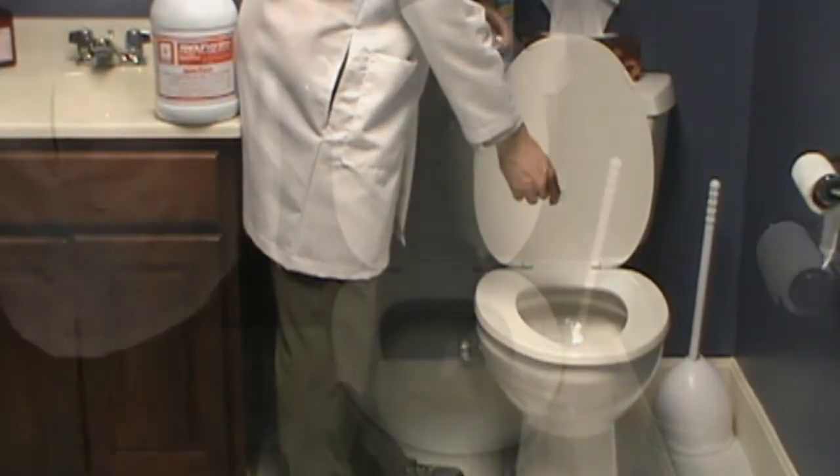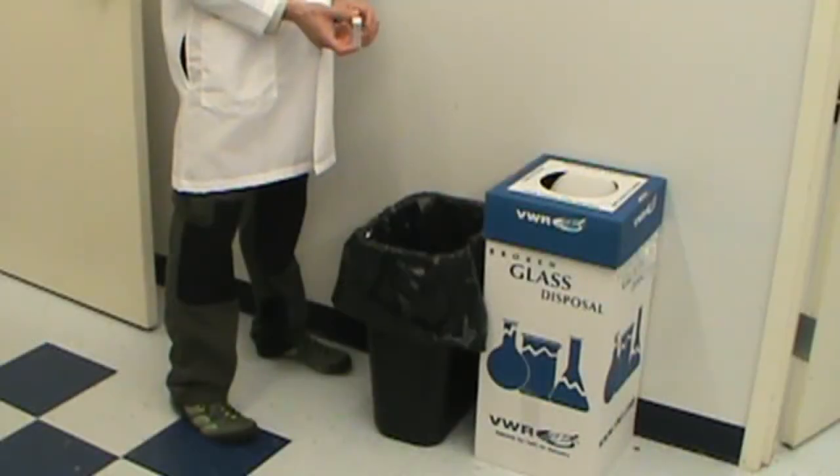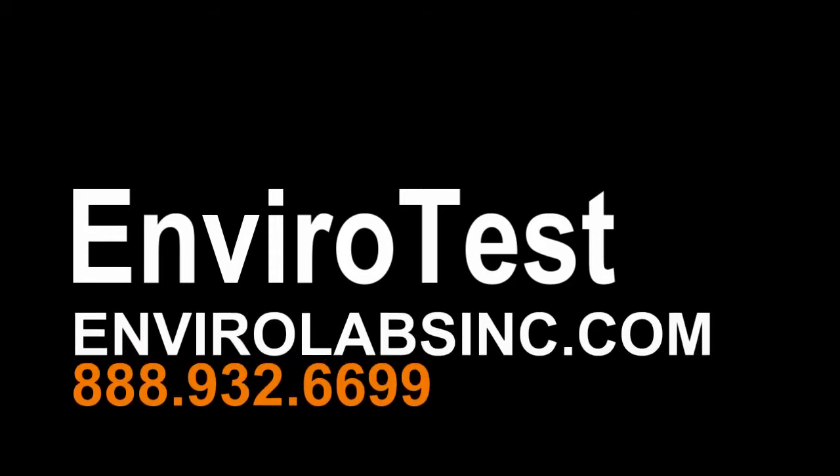Replace the lid and dispose of the vial by placing it in a trash can. Be sure to wash your hands immediately after this process. Thanks for using one of our test kits from EnviroTest. Please visit us on the web or give us a call for all of your environmental testing needs.